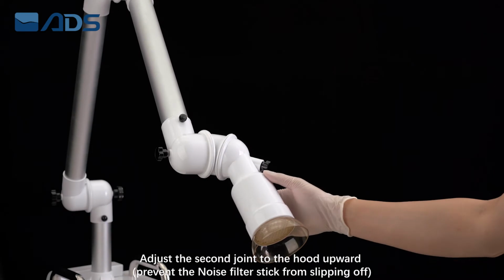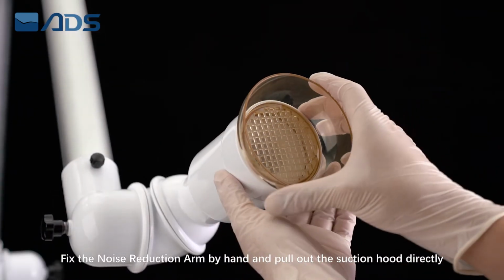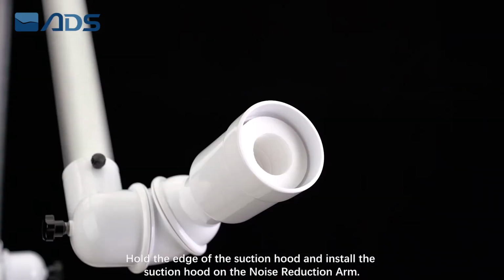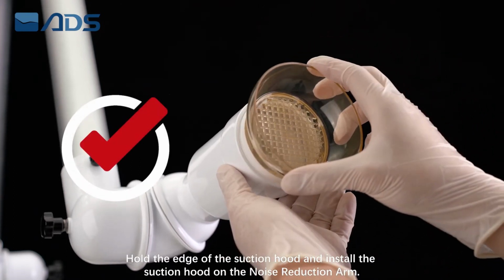Adjust the second joint to the hood upward. Fix the noise reduction arm by hand and pull out the suction hood directly. Do not sterilize the suction hood, just wipe to clean the hood. Hold the edge of the suction hood and install the suction hood on the noise reduction arm.